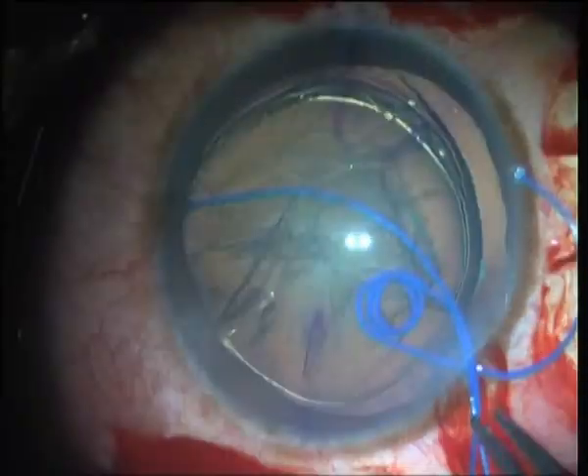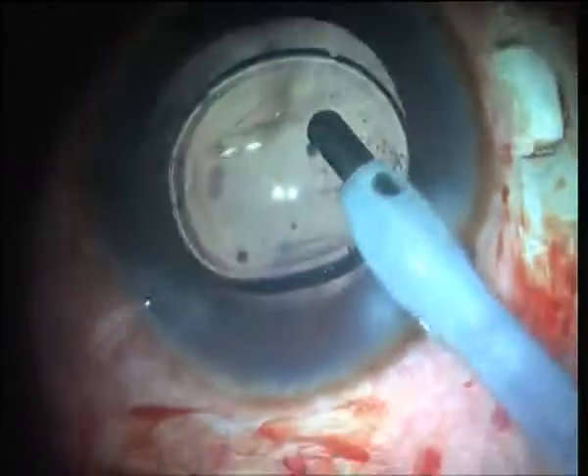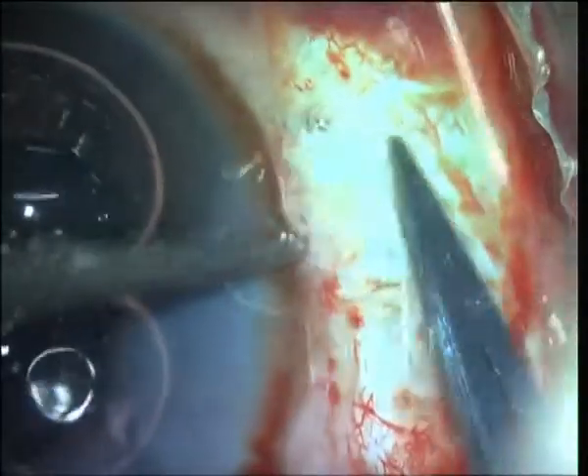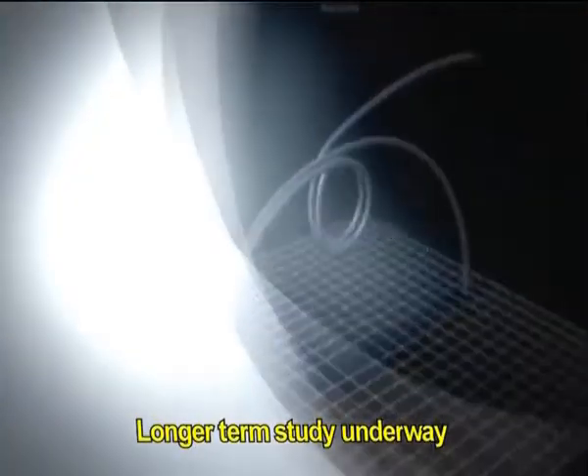To conclude, subluxated cataracts are a surgical challenge. The glued ECHR has given encouraging results for sutureless fibrin glue-assisted trans-scleral fixation of the capsular bag.